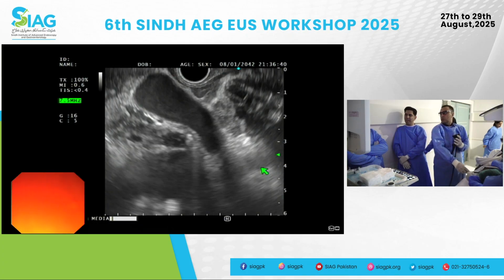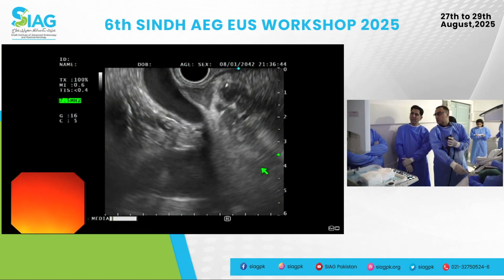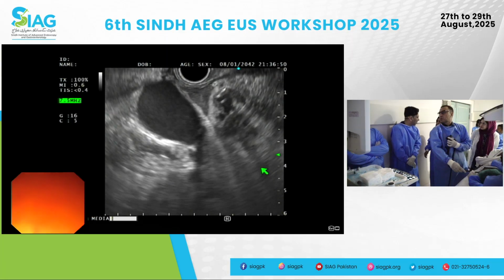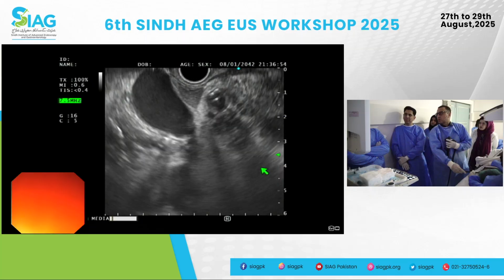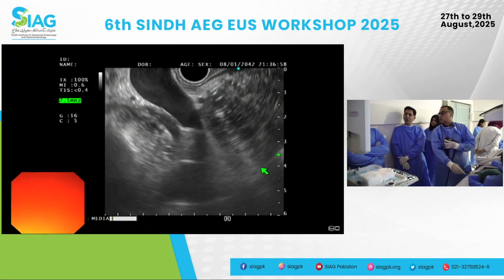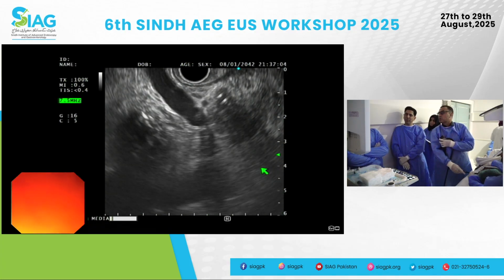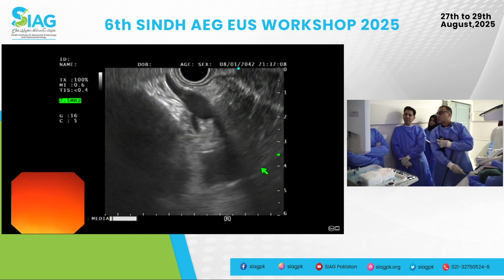Correct. And the other problem that I've been told is that there's an elevated CA19-9 as well. Is that correct? Yes, it's not remarkable. How much is it? 195. Is it very high? Well, okay, fine. So we are now going toward the distal CBD, clockwise. Keep going.